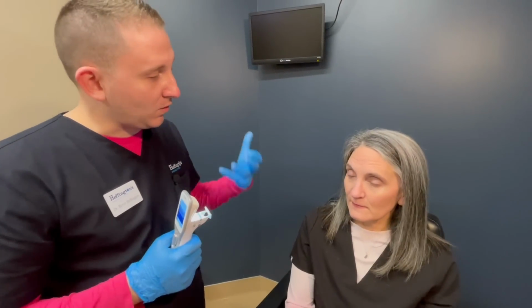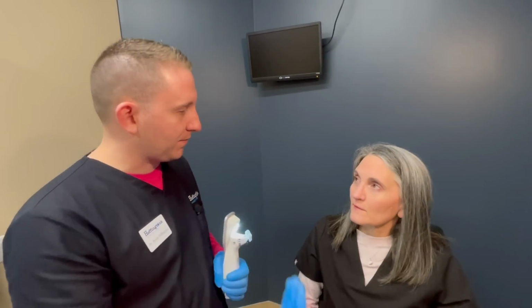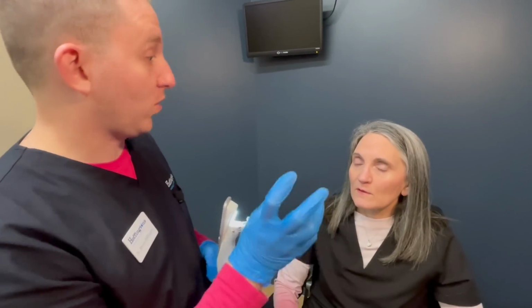Great. Feels very wet. Good. We like very wet. Once we get that oil back, it should start filling in some of those areas that your cornea is a little irritated on. Did you see some stuff coming out? No, it just looks like regular oil. We're just promoting more of the glands to open up. Because you had a couple of them that we're doing, but you need more doing them.